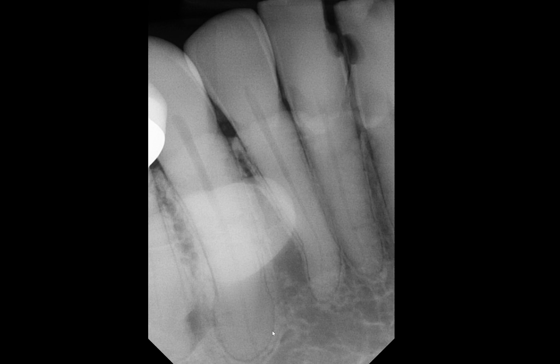Here we have the canine — lower right canine. Look at the overall shape of the root as we follow the PDL space as best as we can. About this area, it appears that the apical portion is even more bulbous and actually larger than the rest of the root.